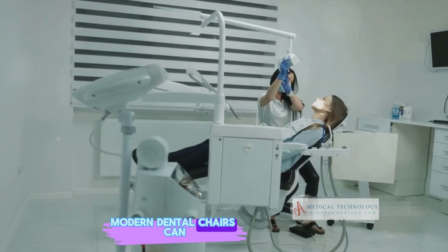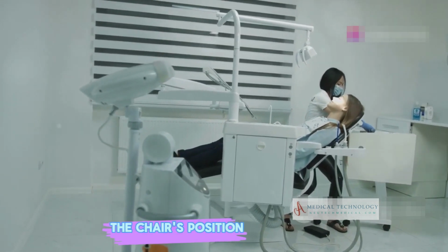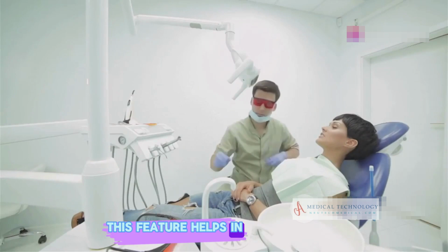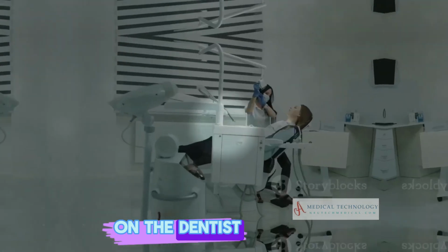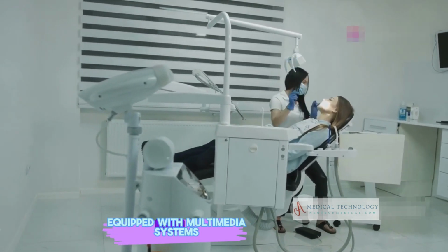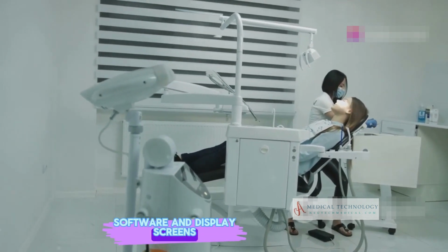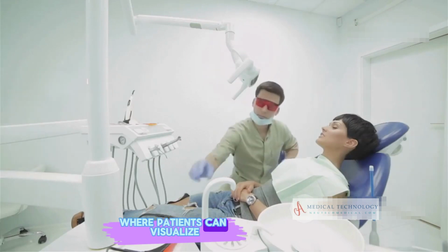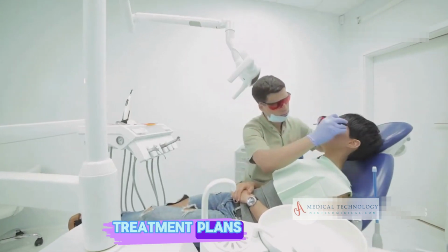Modern dental chairs can be operated via voice commands, allowing dentists to adjust the chair's position without manual intervention. This feature helps in maintaining sterility and reduces physical strain on the dentist. Multimedia integration. Dental chairs now come equipped with multimedia systems that connect to imaging software and display screens. This integration supports an educational framework where patients can visualize their dental health issues and understand the proposed treatment plans.